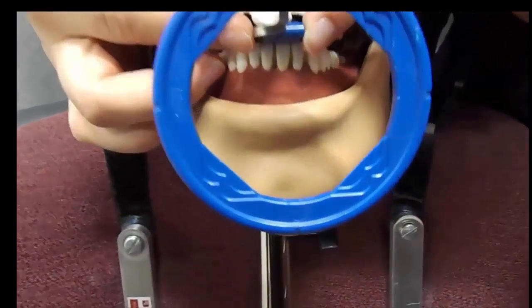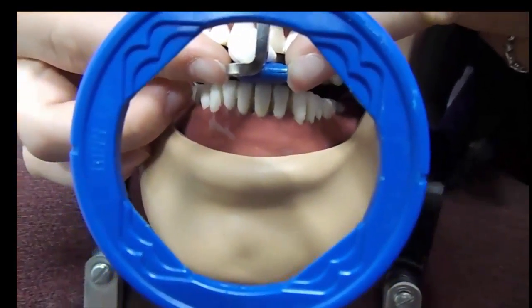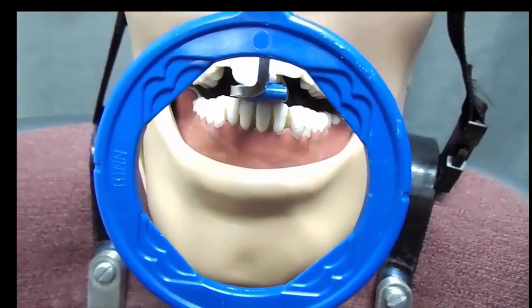Look through your ring. Make sure that the teeth you want to see on the image are positioned between the outer edge of the metal bar and the outer edge of the plastic bite block.